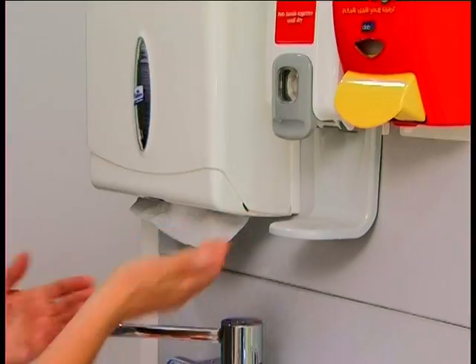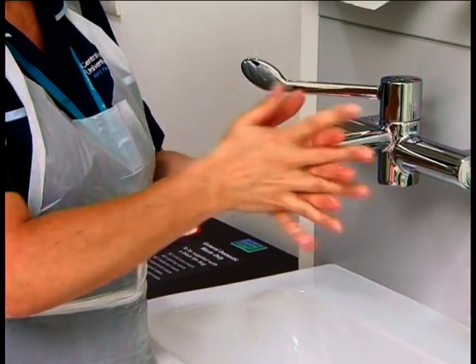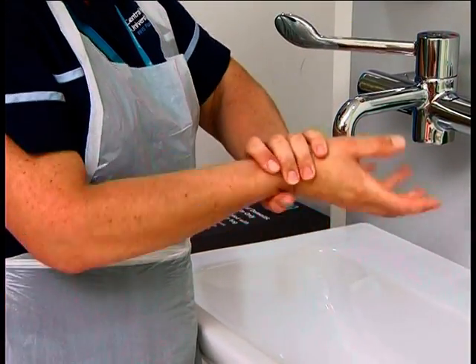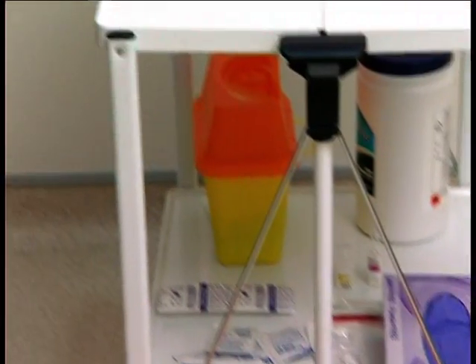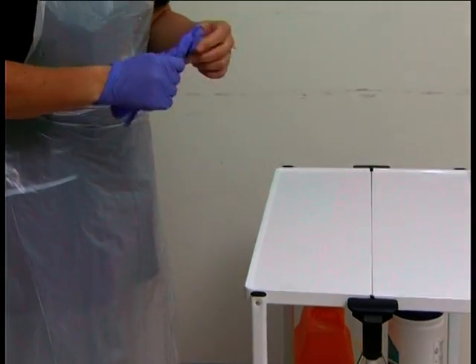Clean your hands with alcohol gel using the same 7-stage technique that you used for washing. Keep rubbing your hands together until the gel is completely evaporated and your hands are dry. Put on a pair of non-sterile gloves. Gloves should be left in the box where they will be protected from dust until you are ready to put them on.